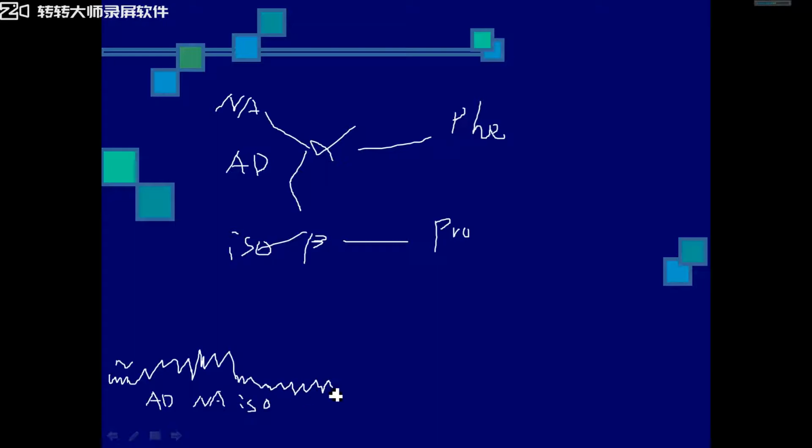Okay, and then we give this, it's normal. We give phentolamine, and we found phentolamine reduces blood pressure. And we give adrenaline again, a little increase in blood pressure. And we give noradrenaline, repeated use. Yes, it can increase blood pressure, but only a little.